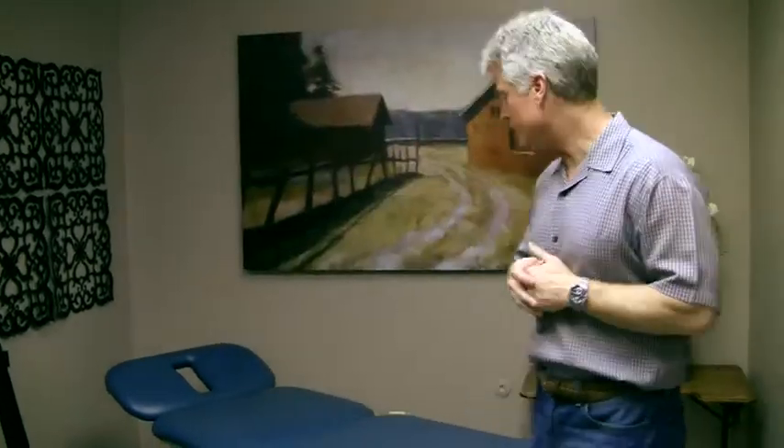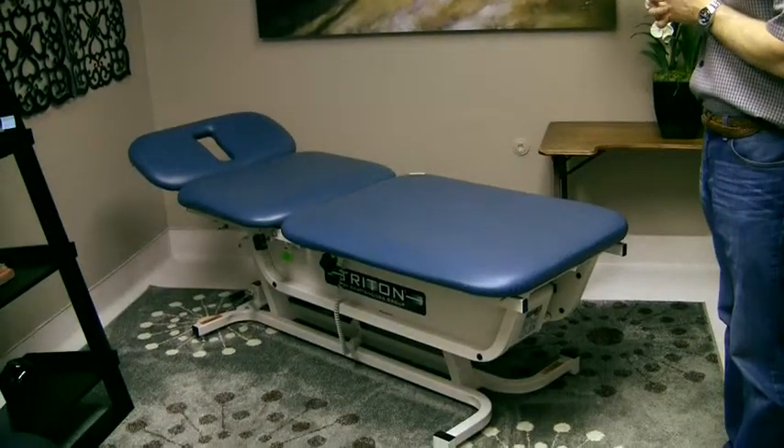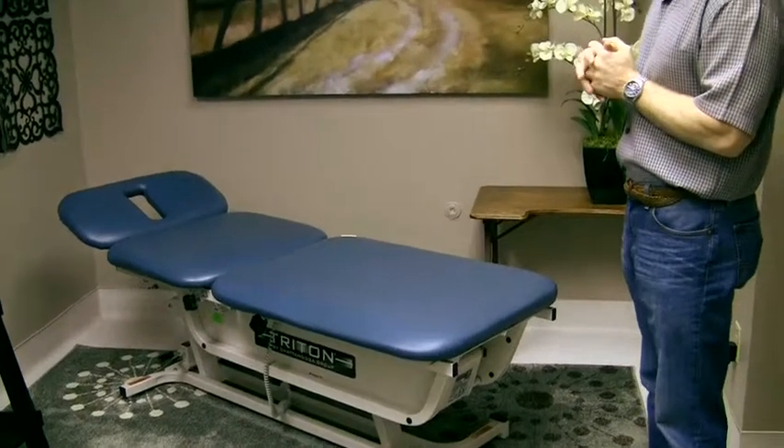It's actually pretty painless. The patient just lies back on the exam table, and one of the team members puts on little sensors — it doesn't hurt at all. In just a minute you get a Bioelectric Impedance Analysis. It's important that the patient is hydrated when they take the test, and the lifestyle educators go through all of that when they take a patient through it.